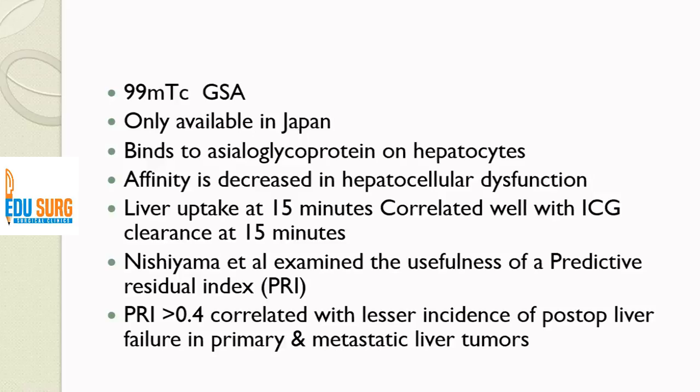The Japanese data has already shown that the liver uptake at 15 minutes correlated well with the ICG clearance at 15 minutes, which is the gold standard for them. Also, they have come up with a predictive residual index cutoff of 0.4, which correlated with a lesser incidence of post-operative failure in primary and metastatic liver tumors.